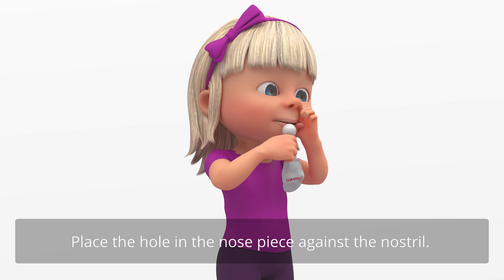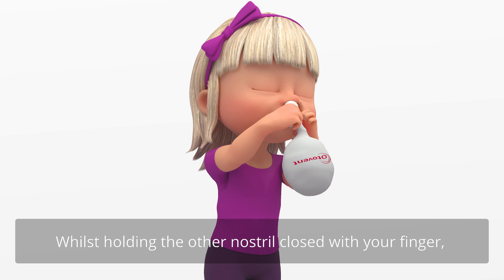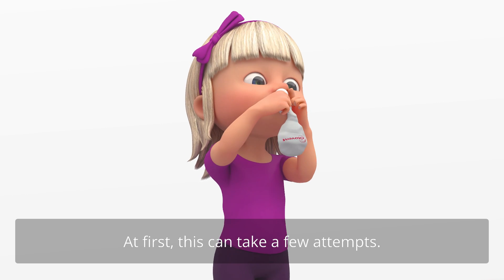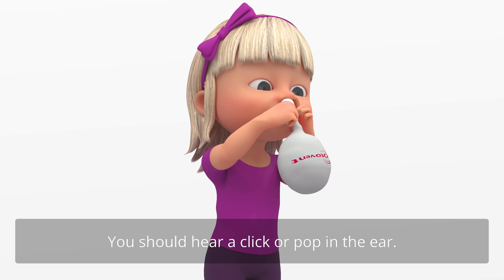Place the hole in the nosepiece against the nostril. Whilst holding the other nostril closed with your finger, blow up the balloon to the size of a grapefruit. At first, this can take a few attempts. You should hear a click or pop in the ear.